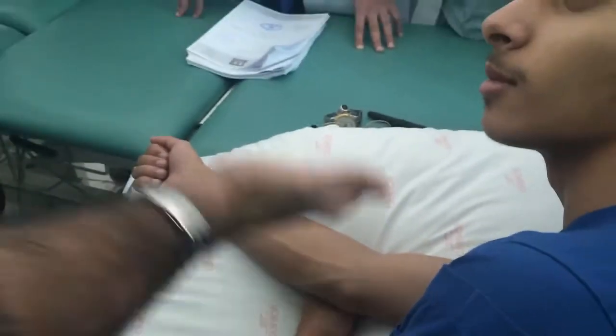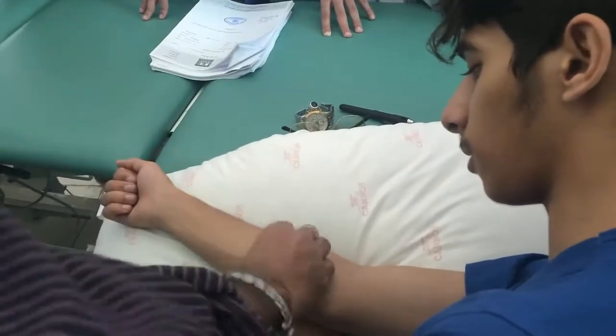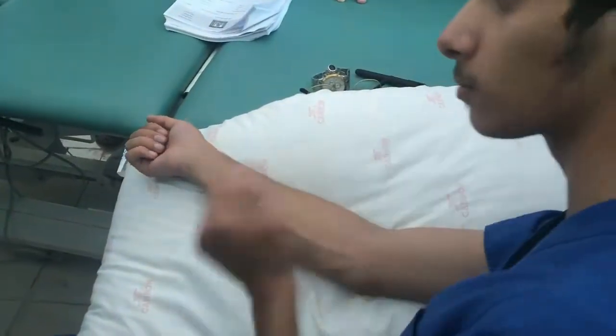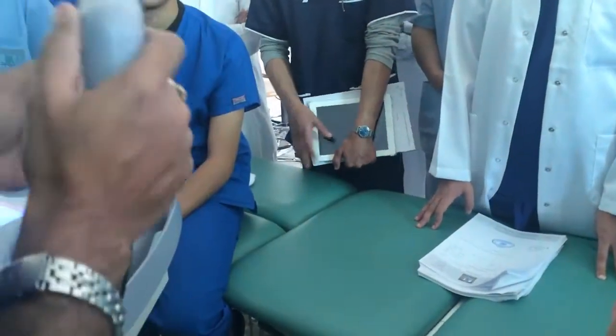It's a little bit firm contact, slowly and slowly. Don't get confused, I said pain. For an open wound we should not touch. Scanning method: we are just scanning the wound without touching. Grid technique we can touch.